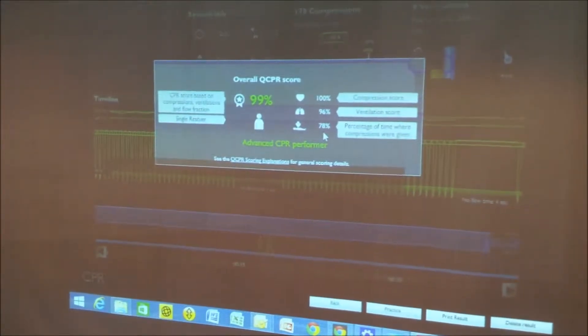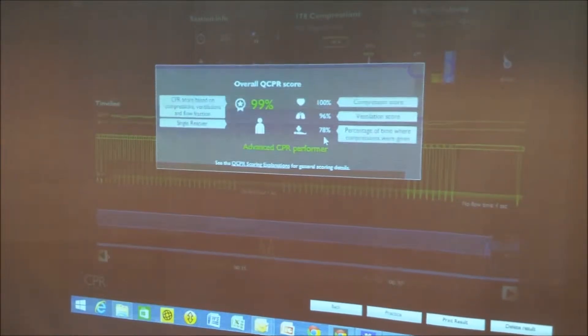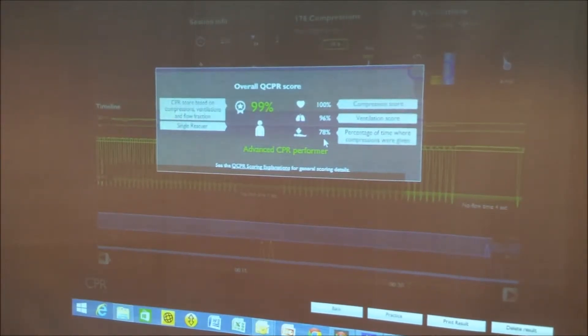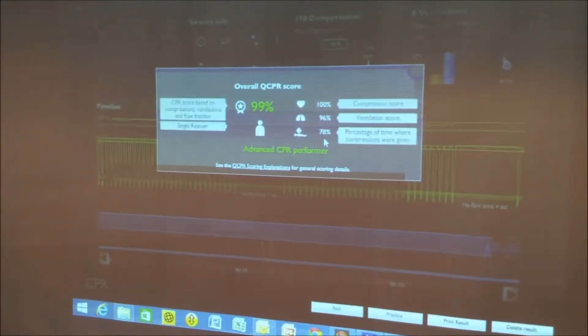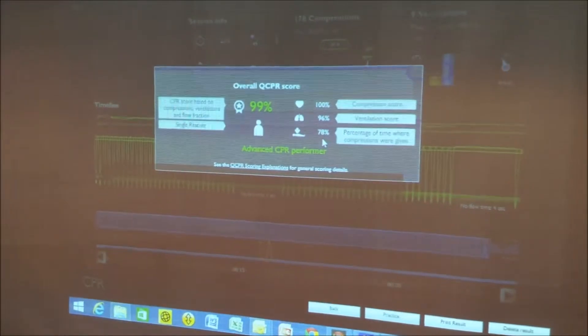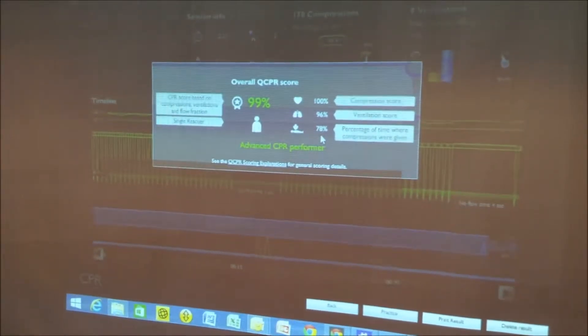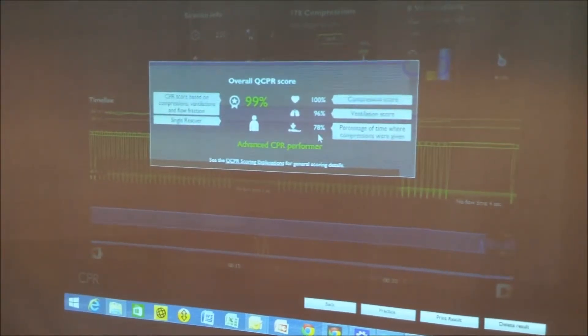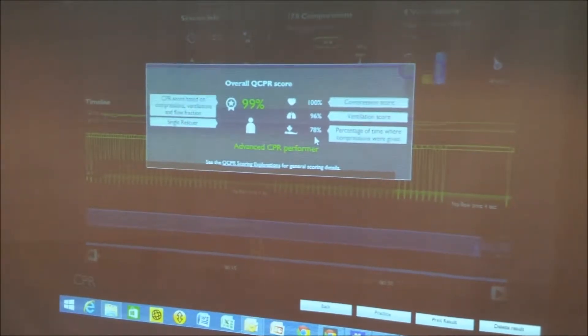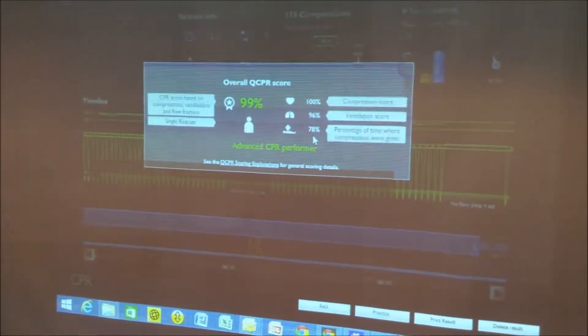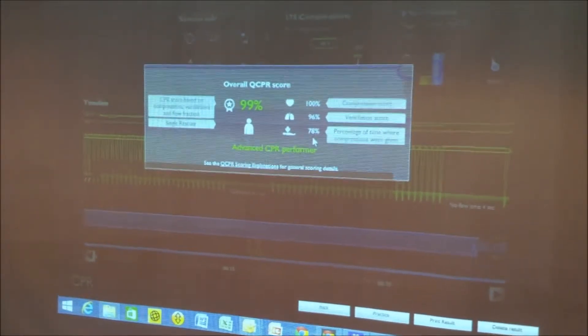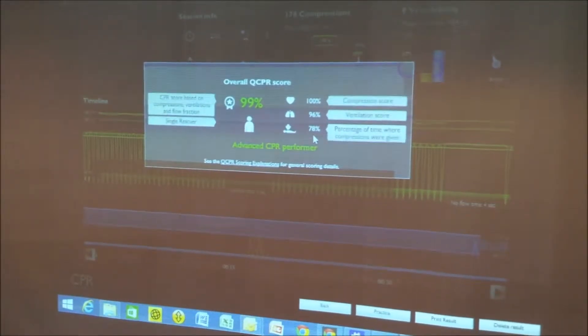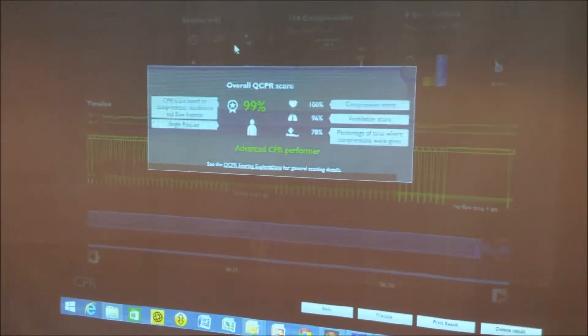This is the chest compression fraction and this demonstrates the amount of time the person was on the chest during the two minutes that they were performing CPR. And global research now tells us that that percentage really needs to be about 80% because it's linked to much higher survival rates for patients.